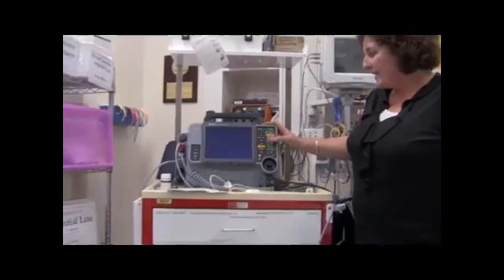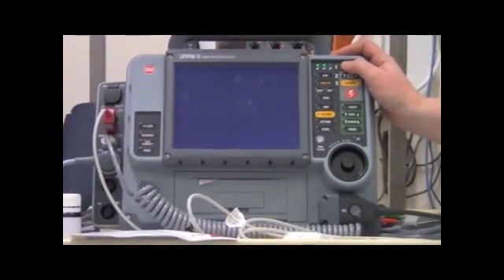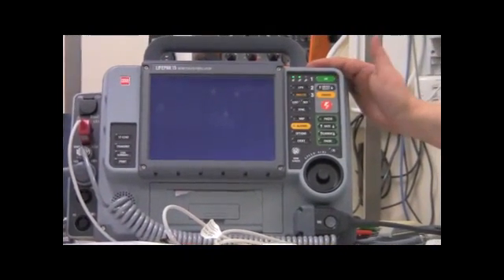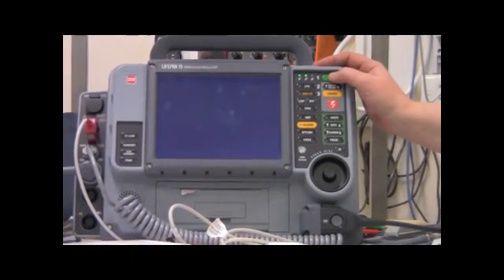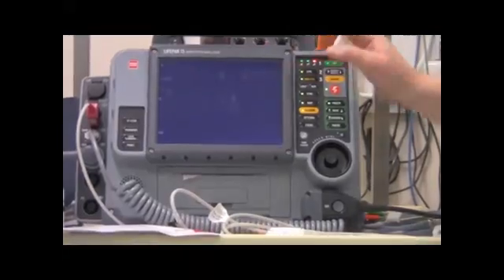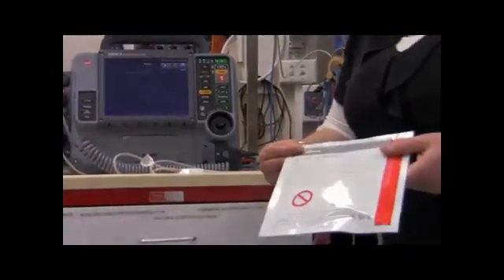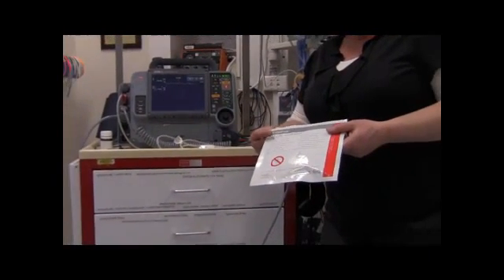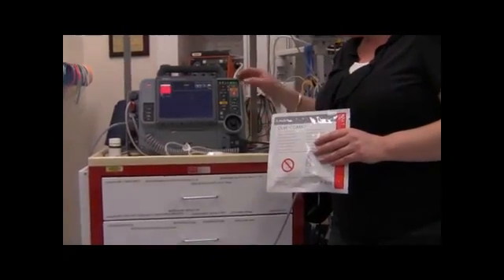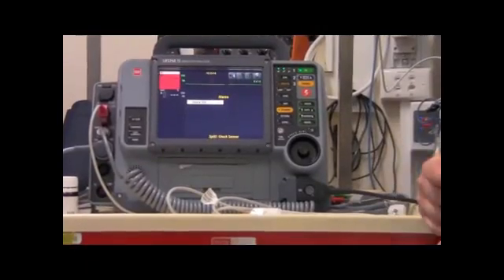So basically it has two sides to it. It has a semi-automated capability as well as fully manual capability if you need to shock someone. What you need to do is turn the on button, self-explanatory, and then most of the machines come with some quick combo paddles, which you're able to monitor patients through as well as defibrillate patients through. So it's all hands-free now, which makes it really easy and it's safer.